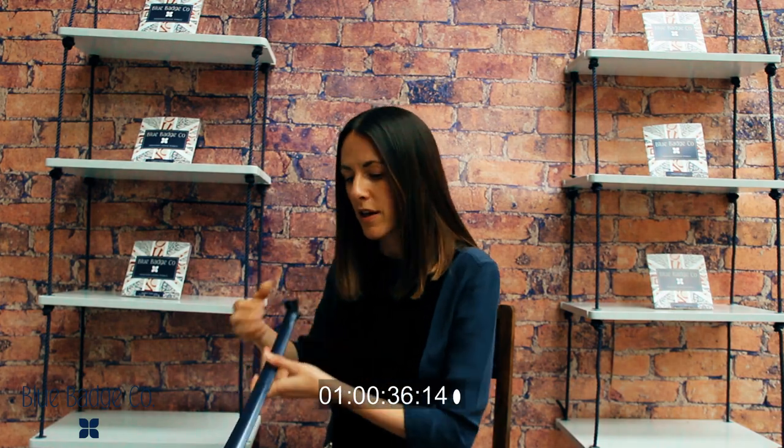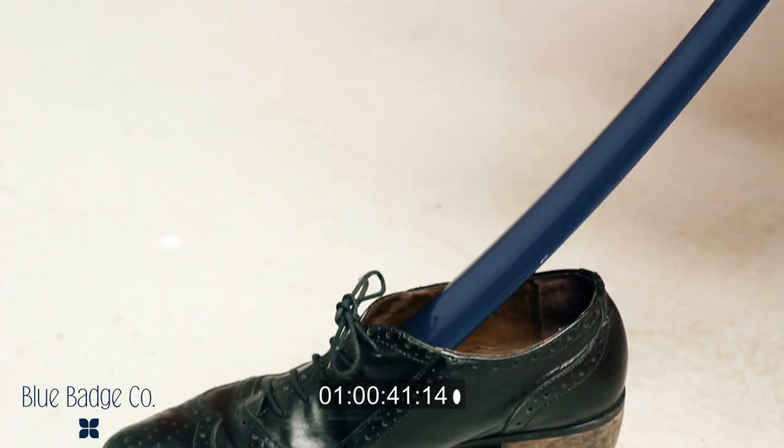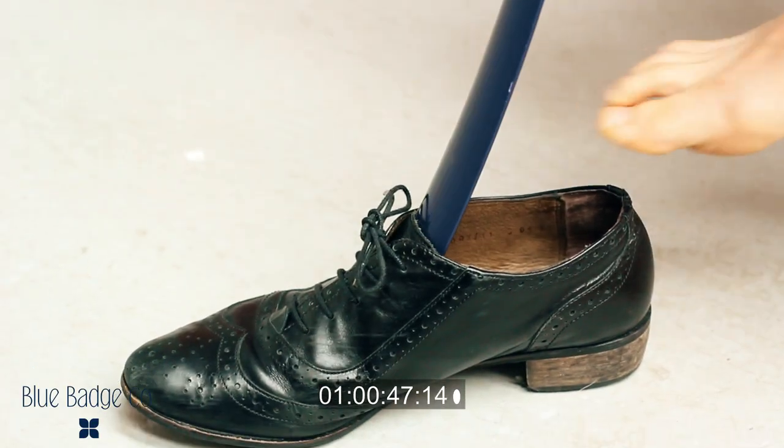Simply take the shoe horn for putting a shoe on and turn it around so that the logo on the shoe horn faces you. This enables you to put it into the toes of the shoe and lift the tongue upwards. You can then slide your toes into the shoe.